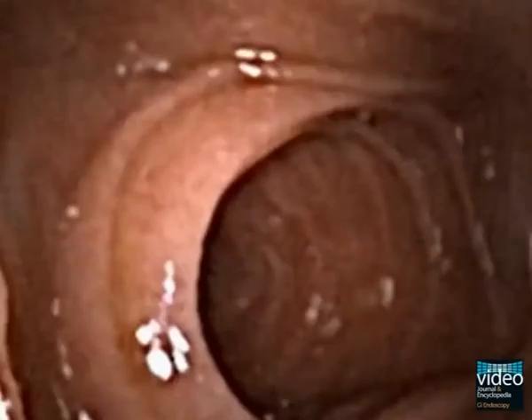There is complete villus atrophy visualized in the duodenum and the proximal small bowel. Submucosal vessels are showing through. There is a loss of the duodenal and jejunal folds and a nodular and mosaic pattern of the mucosa, with scalloping of the circular folds may be noticed.